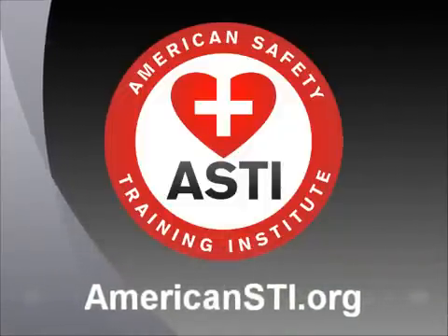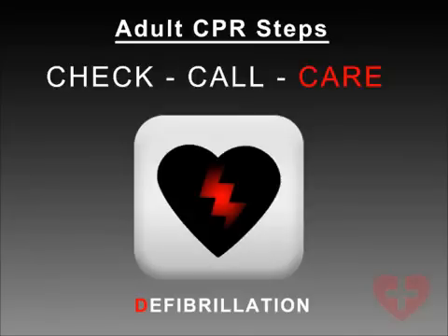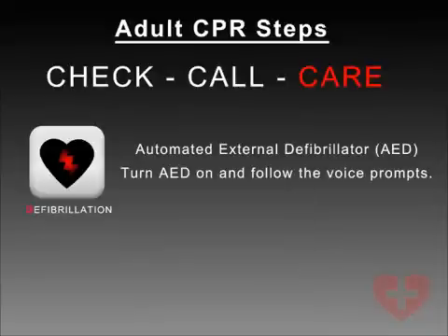Adult AED. Defibrillation — Automated External Defibrillator AED.